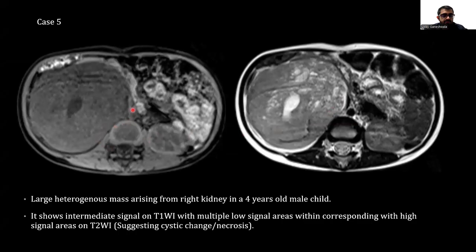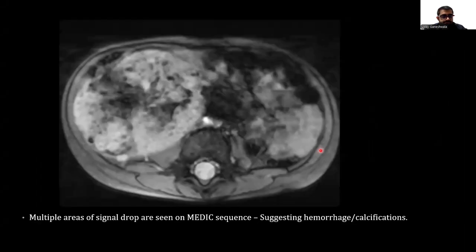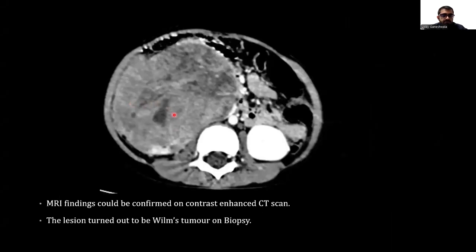In this case, we can see a large heterogeneous mass arising from the right kidney in a four-year-old male child. It shows intermediate signal on T1-weighted images with multiple low signal areas corresponding with high signal areas on T2-weighted images suggesting cystic change or necrosis. The lesion shows areas of diffusion restriction on DWI-ADC images, and multiple areas of signal drop are seen on ME-DIC sequence suggesting hemorrhage or calcification. MRI findings were confirmed on contrast-enhanced CT scan. The lesion turned out to be Wilms tumor on biopsy.